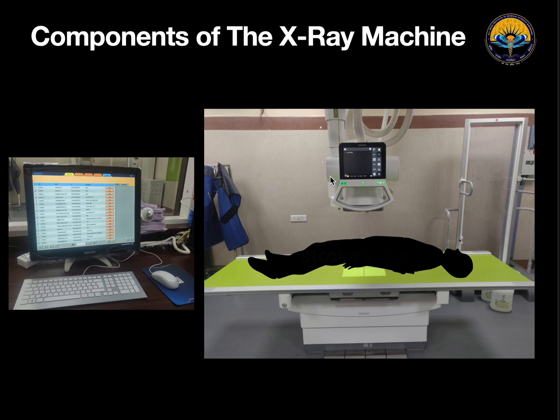Once they are formed, they come out through the window over here, and above this we have filter and collimation system over here. Once the X-rays come out, they interact with the matter, and the final attenuated signal is received on the detector system over here.